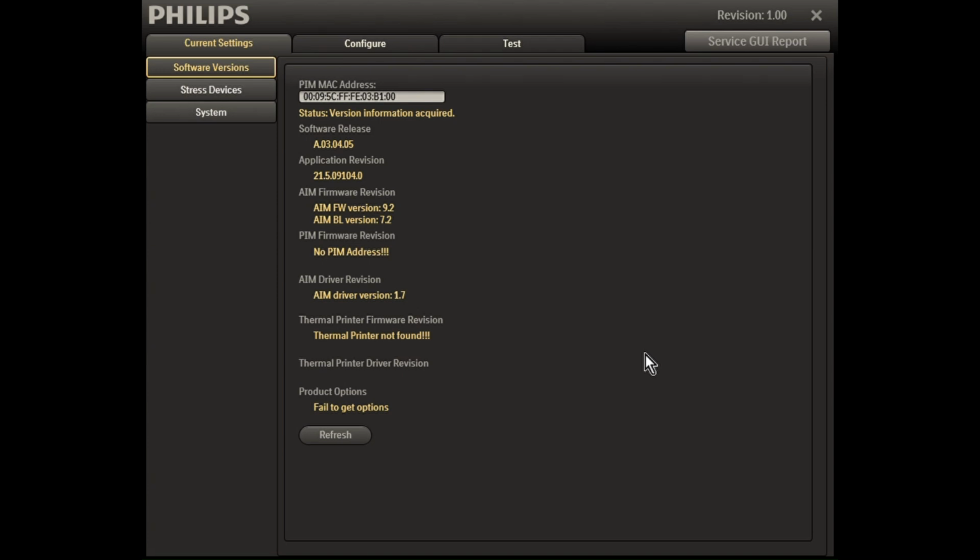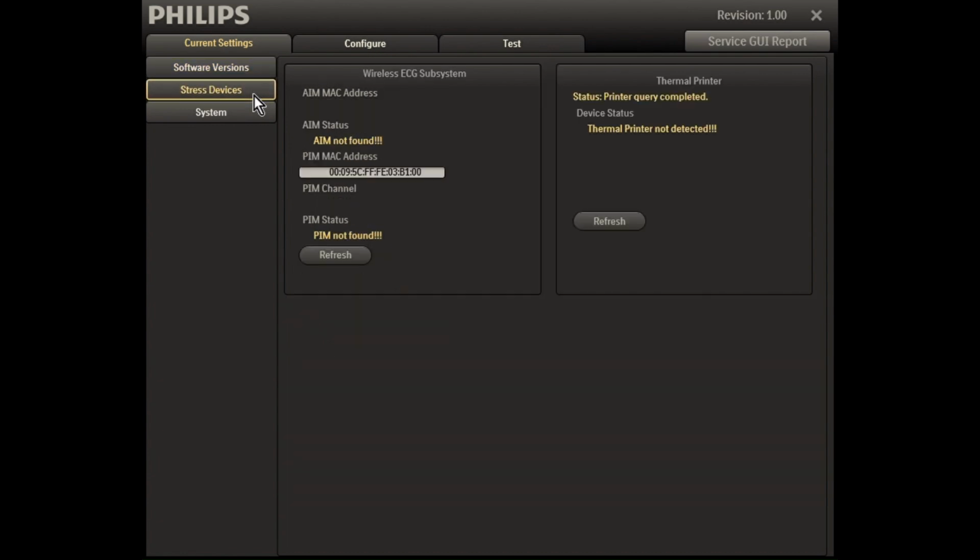If the user or installation professional clicks on service, there is some good functionality within this area to configure and test for various communications. So you can test your PIM and if it can be found or not. Here, I'll turn mine on and then we'll go ahead and refresh. And now we are acquiring information, and that is another way to test the PIM functionality.